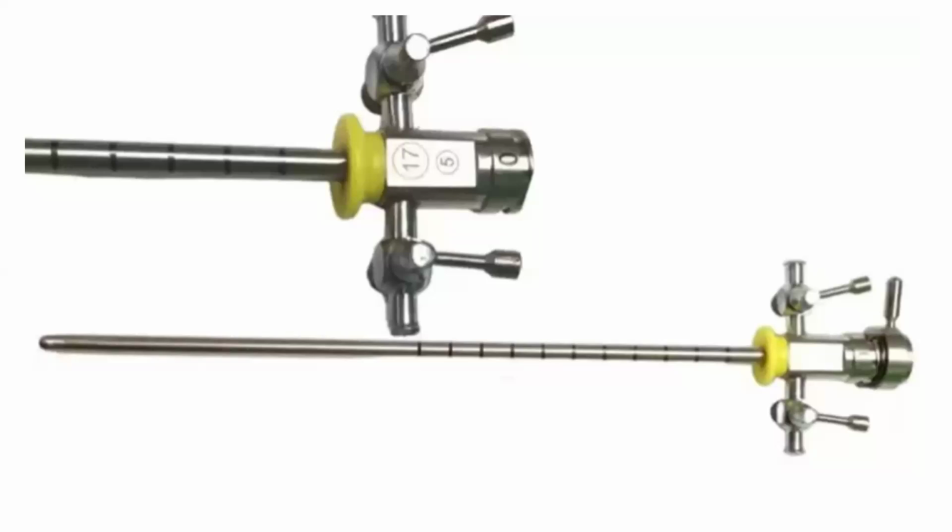It's very simple: diagnostic and therapeutic. So diagnostic cystourethroscopy can be done with the 17 French. For therapeutic, based on the intervention which we are intending to do, the sizes of the sheaths will vary.